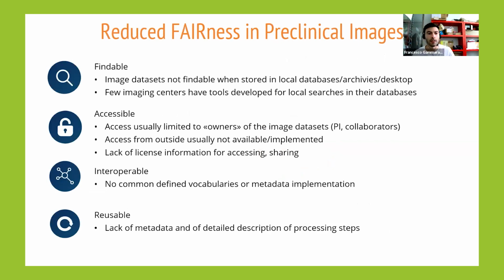At preclinical level, the images are stored in local databases or on local PCs, so they are not findable, and of course, they are not accessible from outside. And from the point of view of interoperability and reusability, information and metadata are not commonly defined. So preclinical centers can use specific vocabularies and terms, but they are not fully recognized by others in the same or in other fields.